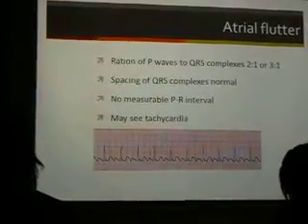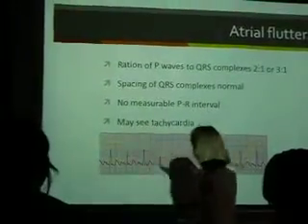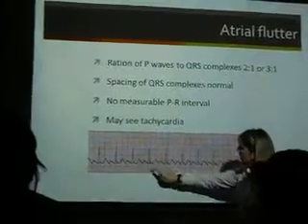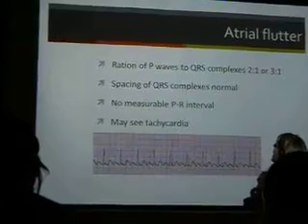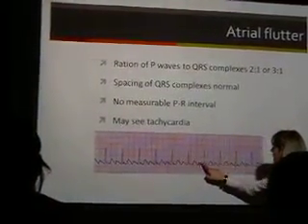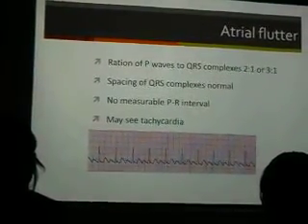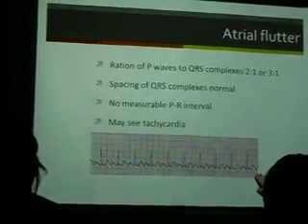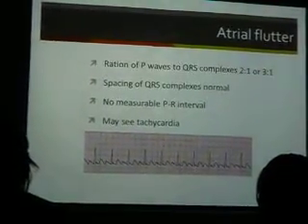Okay, atrial flutter is the next thing that you have. So I want you to look at the picture. Here's the QRS, right? And so what we're going to see here is QRS, then there's a T, and if we keep going, we have QRS, T, P, QRS, T, P, QRS, T. What am I seeing on here? There's something funky on here. I'm wondering if this is the right picture. Does your picture look like this? Yeah. All right. What we should see here is there should be extra P waves.